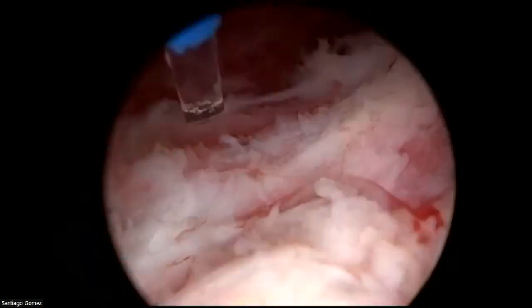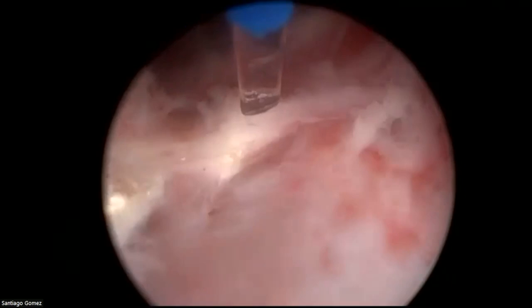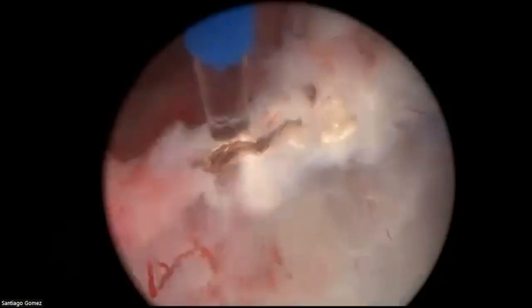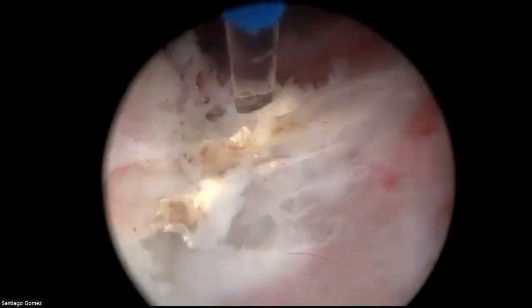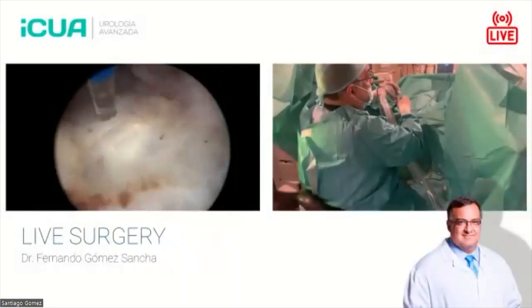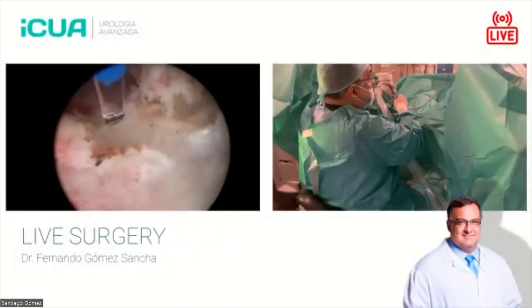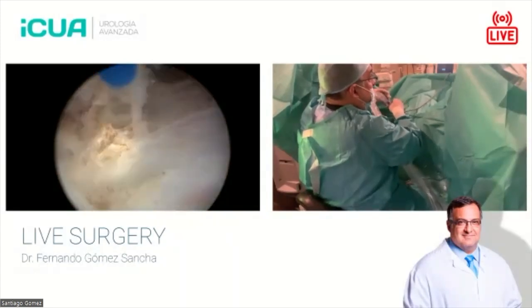So now my next step, this could be a little bit of adenoma too here on this side. So not only that side, but a little bit here. And if this happens, of course, you want to take it out. You don't want to leave adenomatous nodules that could grow in the future. The philosophy of HoLEP is to try to be definitive, to try to be aggressive.